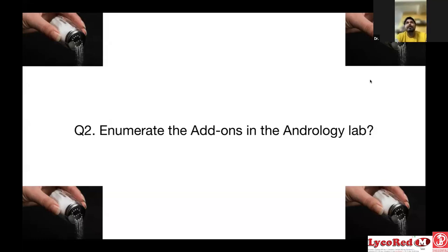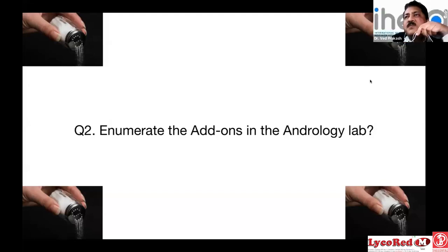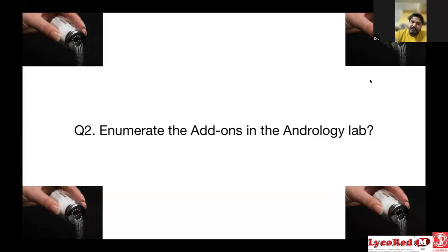And apart from that, automated semen analysis could be an option now. Earlier, we didn't know the TZI. Now automated semen analysis can tell the kinetics, the velocities of motility, and the morphological index of the semen parameters. In that way, we can definitely choose an advanced sperm selection technique. With microfluidics, we can reduce the ROS level as well as DNA fragmentation by choosing advanced sperm selection techniques. Even PICSI we can use for patients with DNA fragmentation.